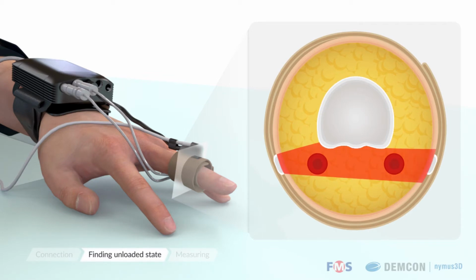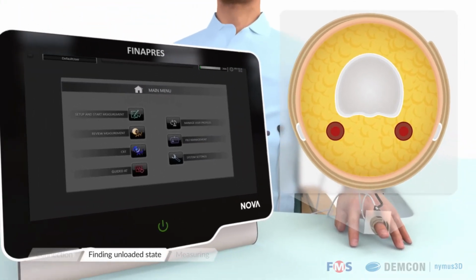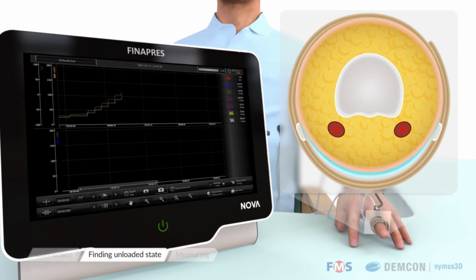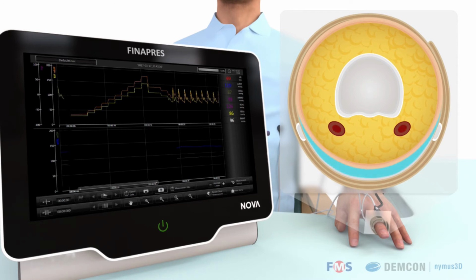Initially, it will assess the artery to determine its unloaded state. Subsequently, the nanocore module will start measuring blood pressure using the physiocal algorithm. The nanocore processes the feedback from the light sensor and dynamically controls the pressure inside the finger cuff to keep the diameter of the arteries unchanged at an unloaded state.